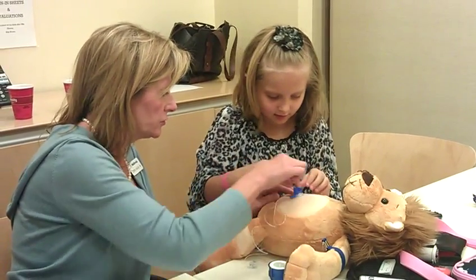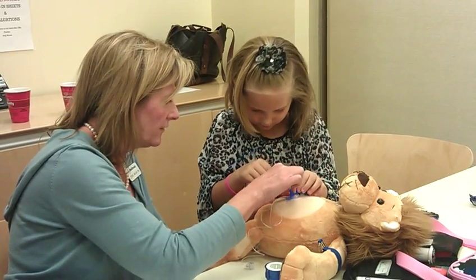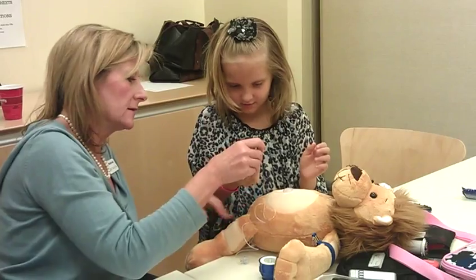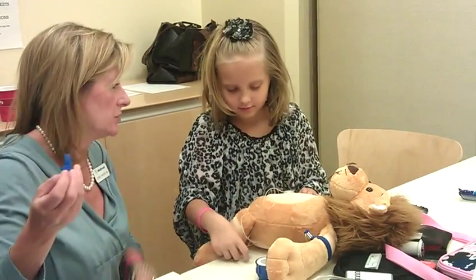Perfect. Now pull straight up. Now that can stick to you, so be really careful. Straight up. Now I want you to hand it to me, and I'll take that. Perfect. The needle. Yes, ma'am. That's exactly what mommy does to you. And he did not make a sound.